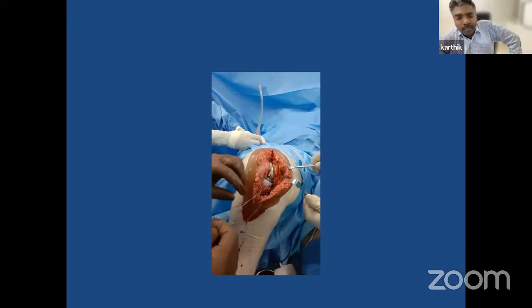So the knee was implanted. It was found out during the trial time itself that the medial side was ruptured. So the knee was implanted, and then after that, the repair was done, because I didn't want to do the repair with the trial on and then disturb the repair again. So we added suture anchors, and then we added a lateral row anchor as well.